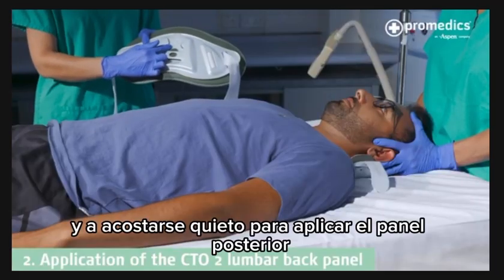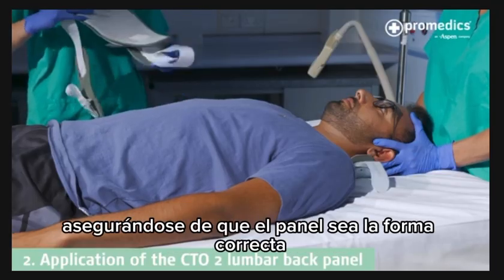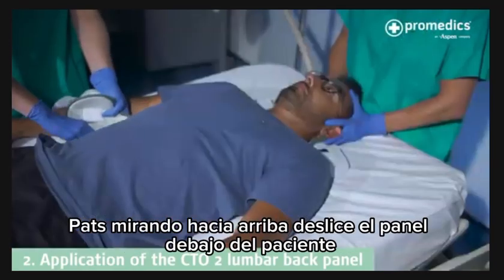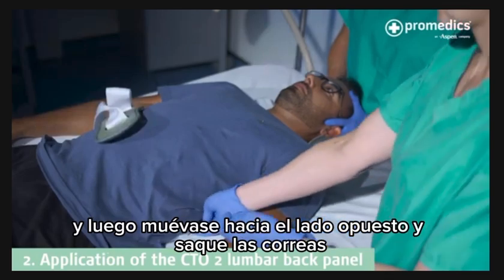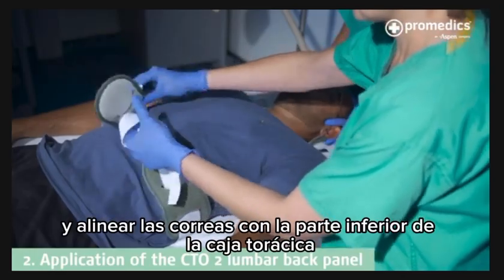To apply the lumbar back panel, position the panel next to the patient in line with the lumbar spine, ensuring the panel is the correct way round with the opening for the posterior strut facing the top as shown. Pads facing upwards, slide the panel under the patient and then move to the opposite side and pull out the straps. Feel for the bottom of the rib cage and line up the straps with the bottom of the rib cage.